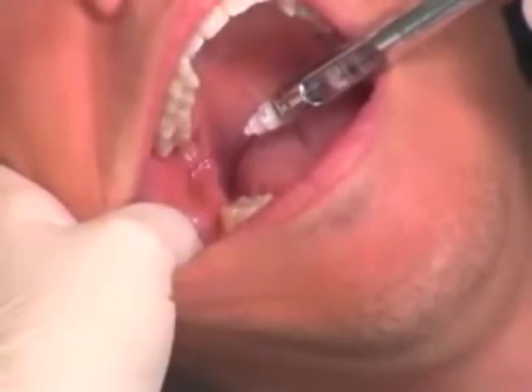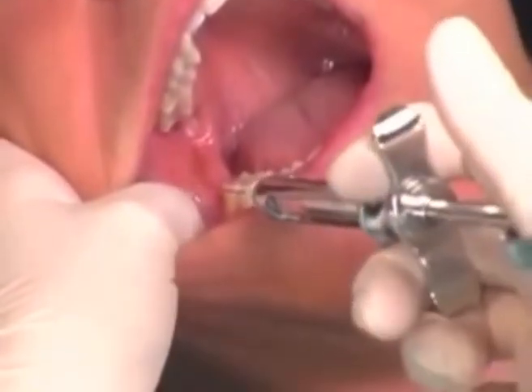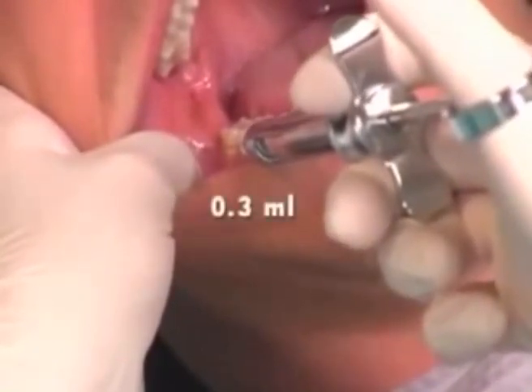The needle is withdrawn, the syringe is repositioned, and the needle reinserted in the mucobuccal fold distal to the last mandibular molar. 0.3 mL of anesthetic is administered.